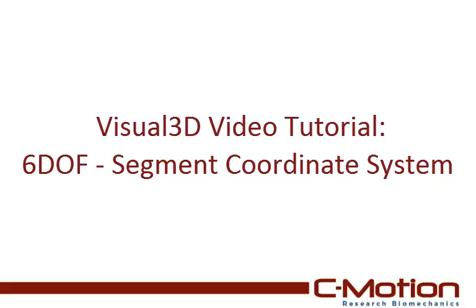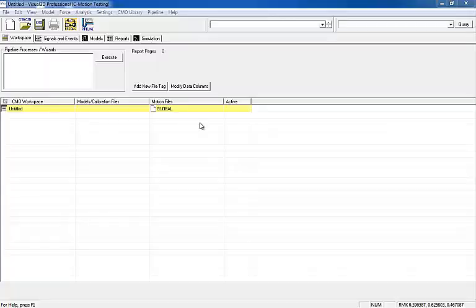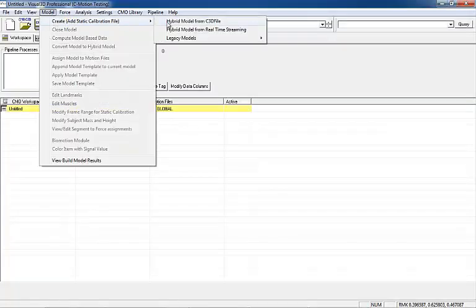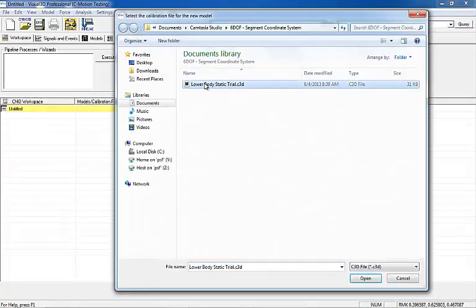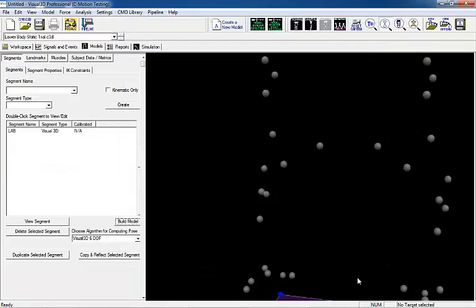This tutorial will explain how Visual 3D defines the segment coordinate system. To create a segment, a static trial must be loaded into the workspace. In this tutorial, only the right shank segment will be created.